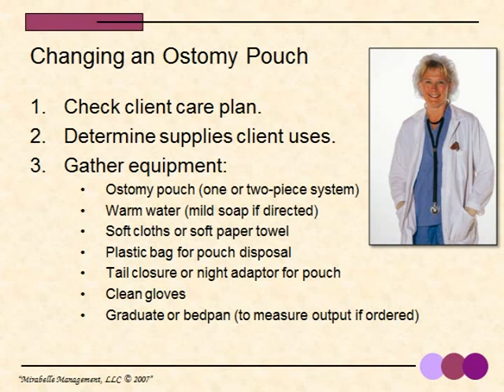Now I'm going to go through the steps necessary to change an ostomy pouch. You can listen to the instructions all day and next week too, but doing it is going to be your best teacher. First, check the client's care plan for any specifics. Second, determine the supplies that your client will be using. And third, gather the equipment.